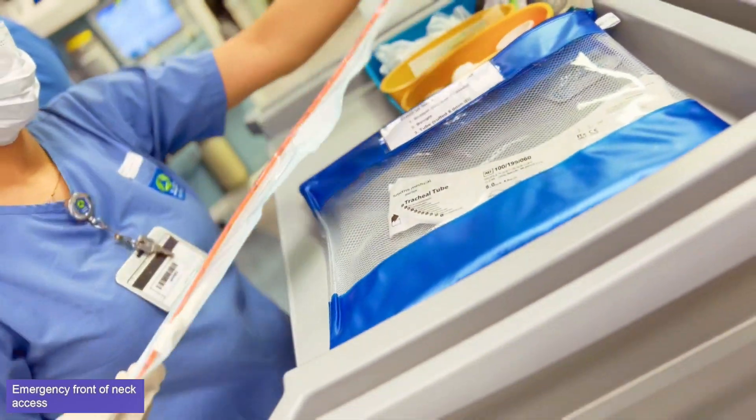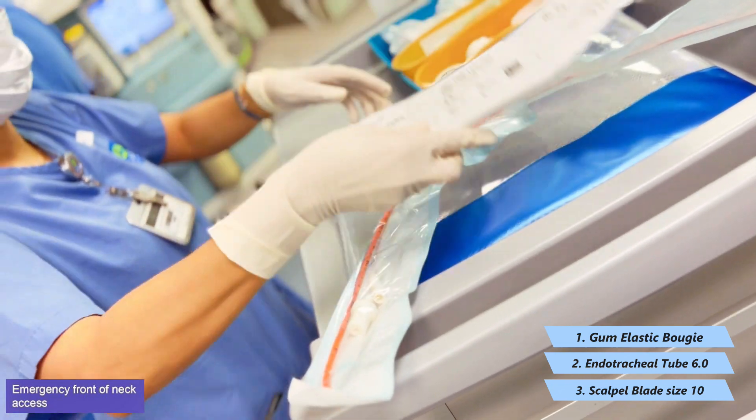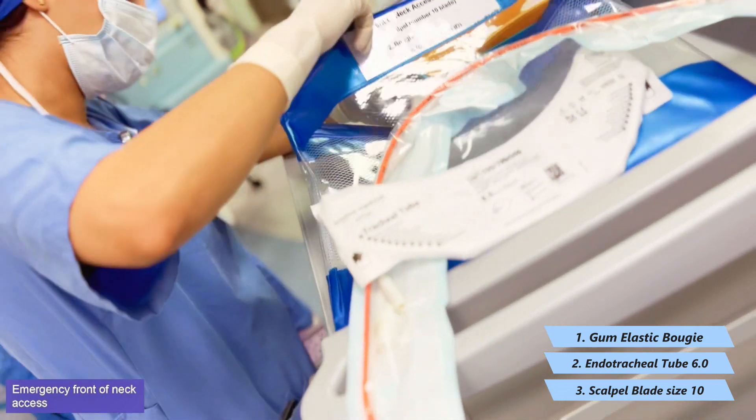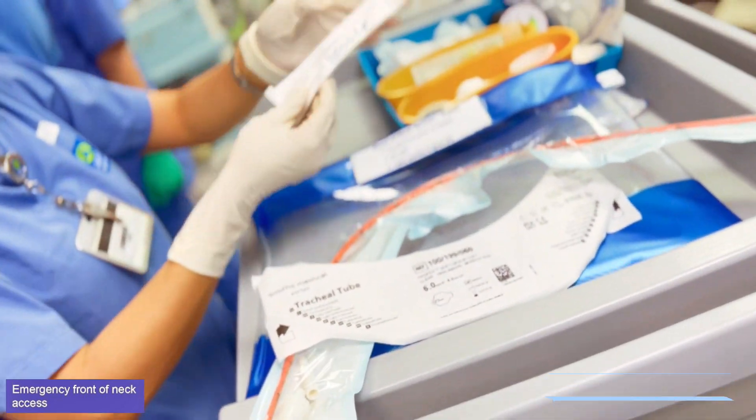The cricothyroidotomy set contains a gum-elastic bougie, a size 6 cuffed endotracheal tube, and a scalpel with a number 10 blade.